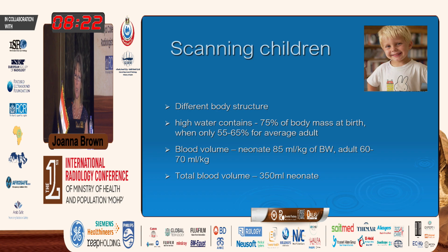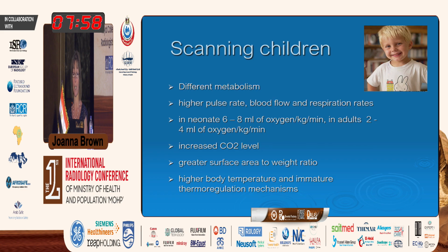Then they have a different blood volume. In neonates, you have 85 milliliters per kilogram of body weight, while in adults it is 60 to 70. So when you inject the contrast in CT or MRI, this should be taken into consideration. The total blood volume is 350 milliliters in neonates, so you need to adjust how much volume of contrast you will be giving.